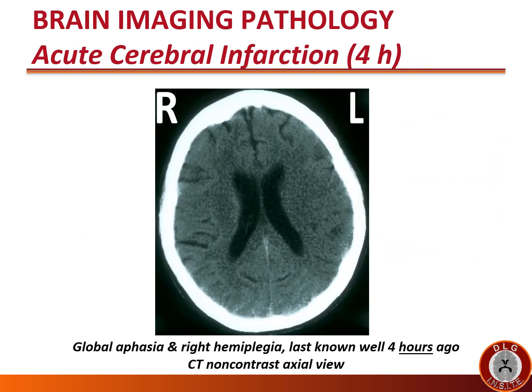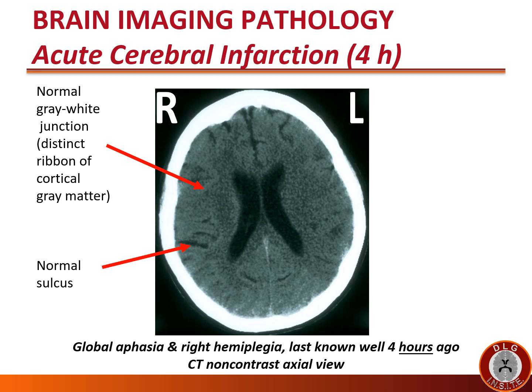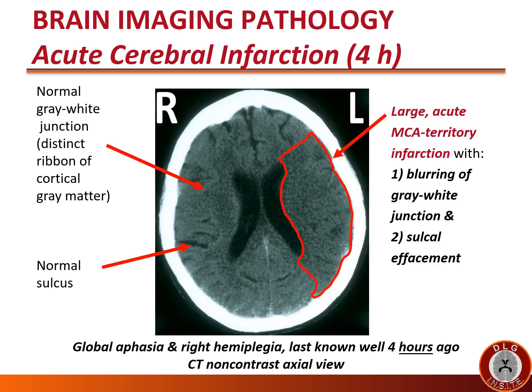This non-contrast CT is from a patient who presented four hours after developing global aphasia and right hemiplegia. Given these deficits, we expect a left cerebral infarction. On the normal right side, one can see the normal gray-white junction — the distinct ribbon of cortical gray matter lighter in color than the subcortical white matter — and normal sulci. The affected left side already at four hours shows a large acute MCA territory infarction with blurring of the gray-white junction and sulcal effacement.